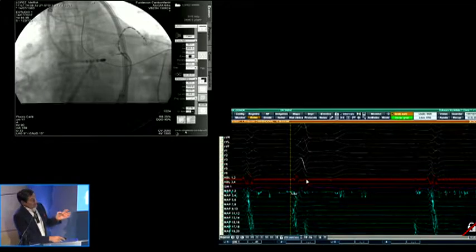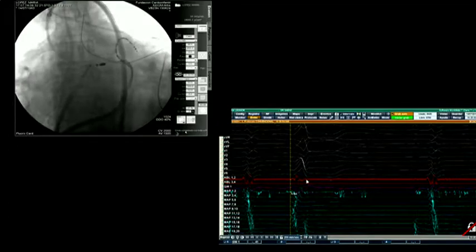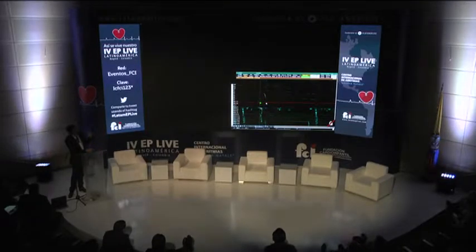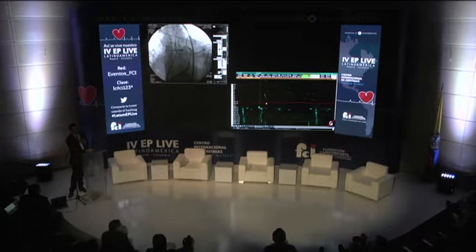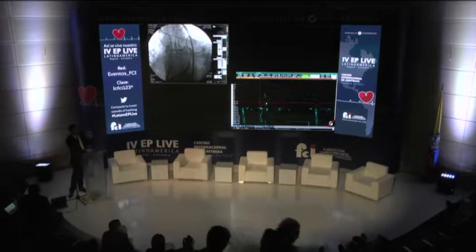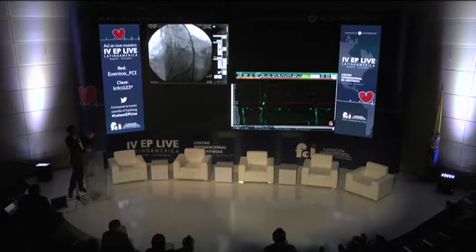What we're talking about now is essential to the interpretation of local electrograms. Where do you put the early activation time? What Fermin just mentioned is very relevant. One of the ways to understand the near field and the far field in complex electrograms is because of the frequency, which is the sharpest part. Here, it is suggesting that this is the local activation and not the first part, which is low frequency. You can see that it's a non-rapid wave.